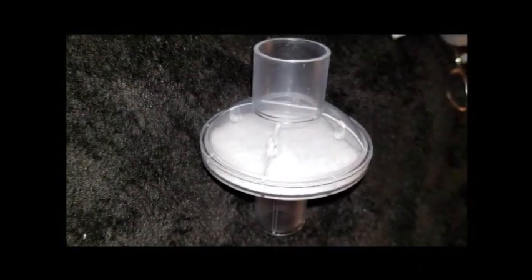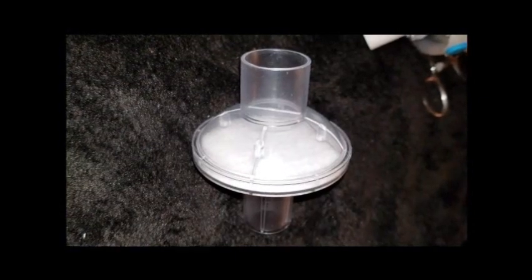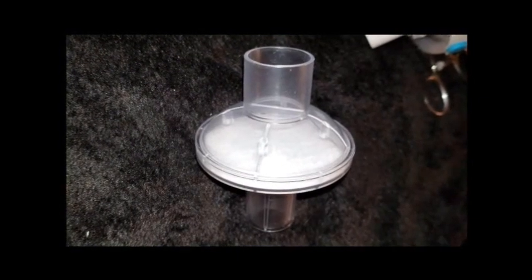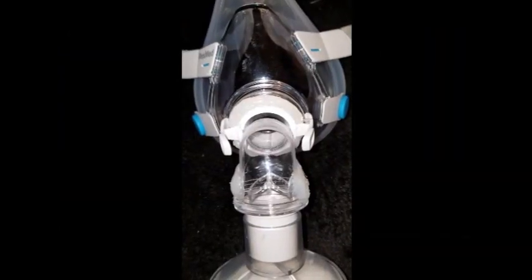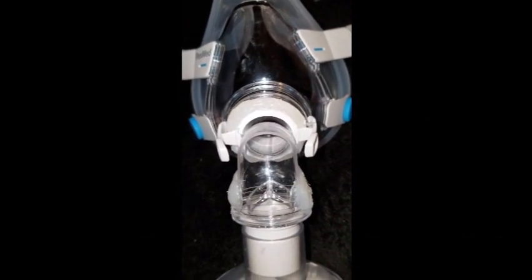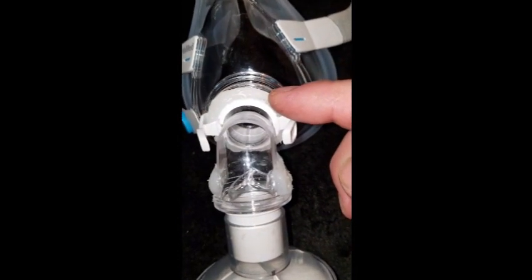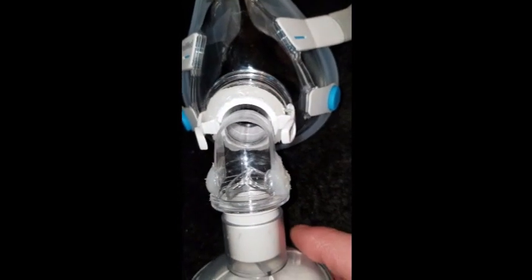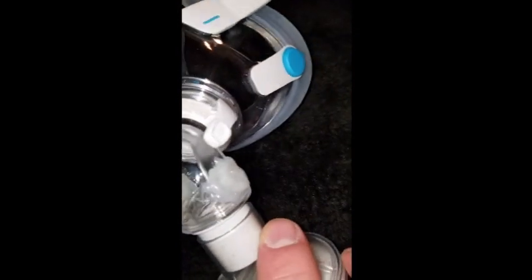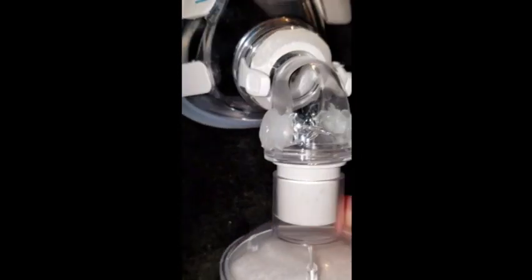This part is the bacterial viral filter that we're going to attach to the end of the mask. Notice what we did right here — we went ahead and hot glued the exhalation ports at the top, so no more little holes. And if you look on the side, we hot glued that too, so no air is coming in and out of those areas.